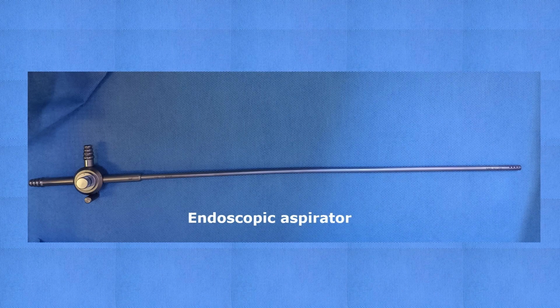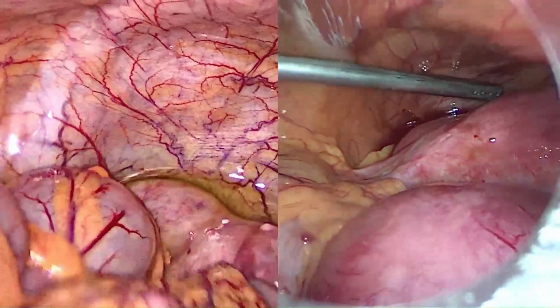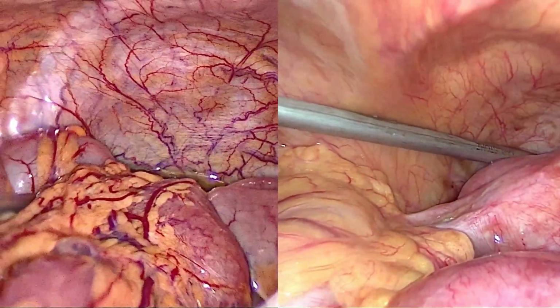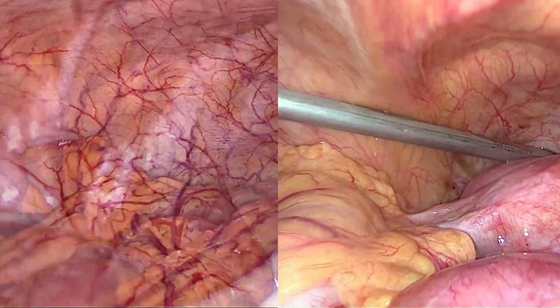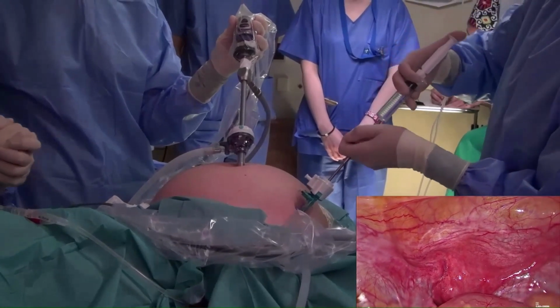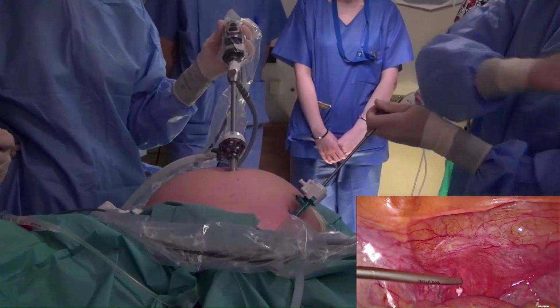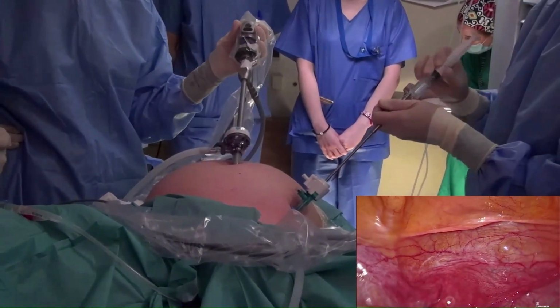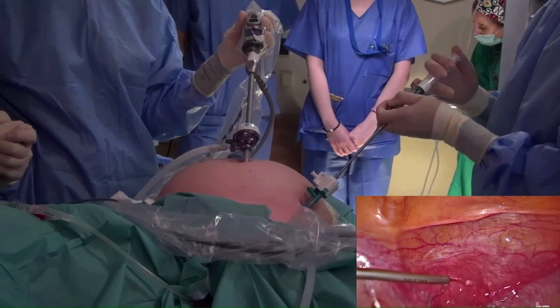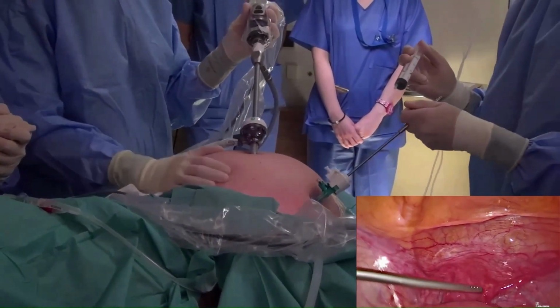After that, we used an endoscopic aspirator and a sterile syringe to aspirate any peritoneal fluid present. The target areas for peritoneal fluid collection are the pouch of Douglas and the vesicouterine space. Fluids contaminated with visible blood must be rejected. After peritoneal fluid aspiration, the peritoneal surfaces must be washed with normal sterile saline solution, moving it carefully through the parietal and visceral peritoneum, helping with manual movements over the patient's abdomen.